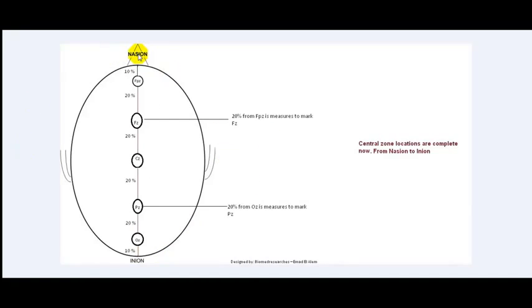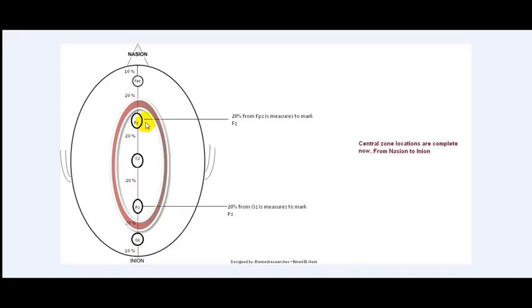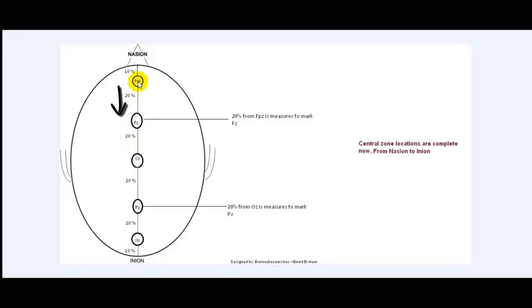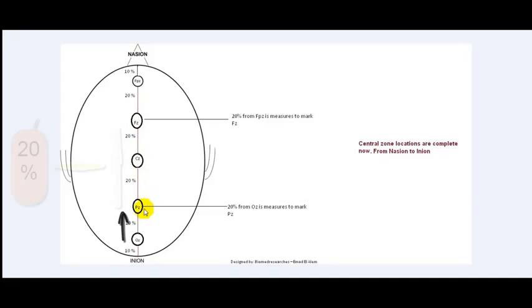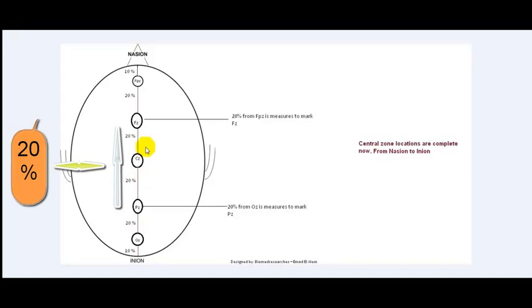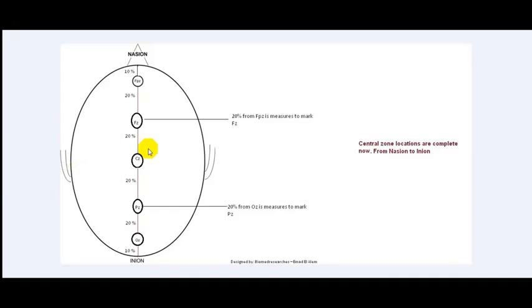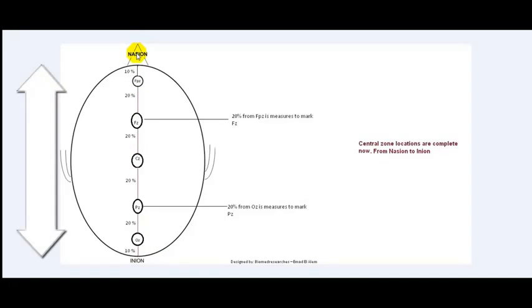Now we have FPZ, CZ, and OZ marked. To mark FZ and PZ, we measure 20% from the frontopolar zone toward the central zone — 20% of 32 centimeters is 6.4 centimeters — and the distance reached is the point of FZ. The same applies to the distance from OZ to PZ. The distance from FZ to CZ, and from PZ to CZ, should automatically read 20% of the total distance, or 6.4 centimeters. Once we connect all these electrodes, we have the central area from nasion to inion connected.